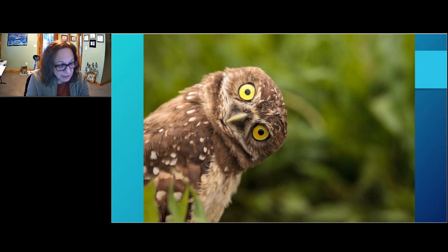That's the kind of stuff you have to look at, just looking at the principles of workflow from dirty to clean. And if you have to backtrack, if you have to go from clean back to dirty and over to clean again, it's a possibility of cross-contamination. So that's probably the broadest, most specific I can get without knowing your specifics.